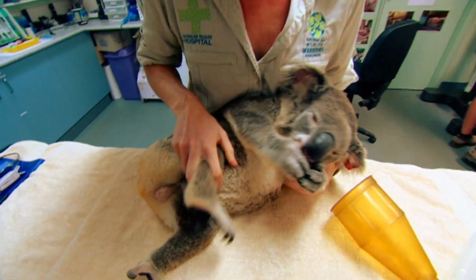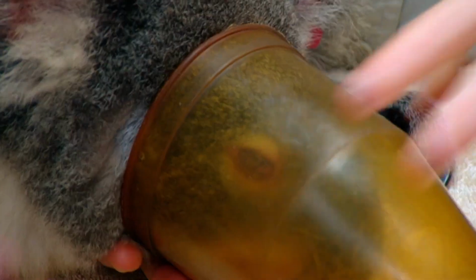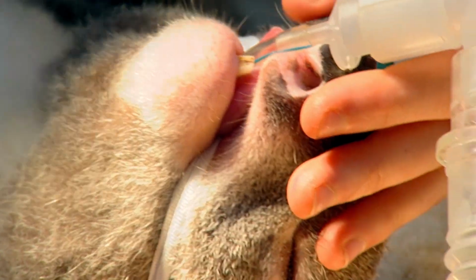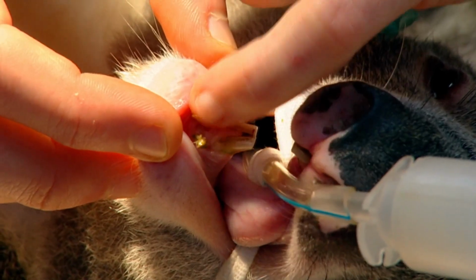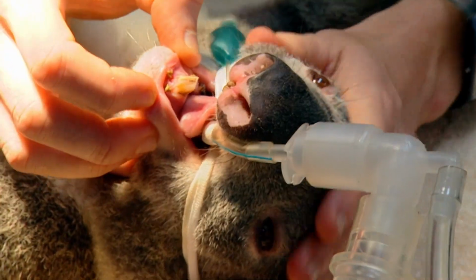Okay, little boy. Let's put you on that mask. He'll get a thorough physical to make sure he's in good general health. And then there's his mouth. Let's have a look at your mouth, Yoda. That looks great. These little green bits are just food matter that's stuck on what remains of the stitches. So I'll be able to take those out today, and it's healed extremely well. It looks really good. I'm very happy with it. I'm just going to X-ray it for the last time just to make sure that fracture site is healed.